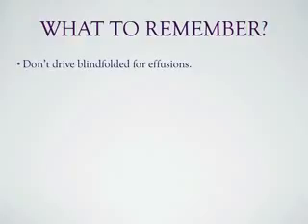So now to conclude, what to remember. First, don't drive blindfolded for effusions. Stethoscopes and physical exams are great. But remember, when it comes to effusions, when it comes to pericardial tamponade, even Beck's triad only occurs in the minority of the exam. The use of ultrasonography greatly enhances your physical exam.